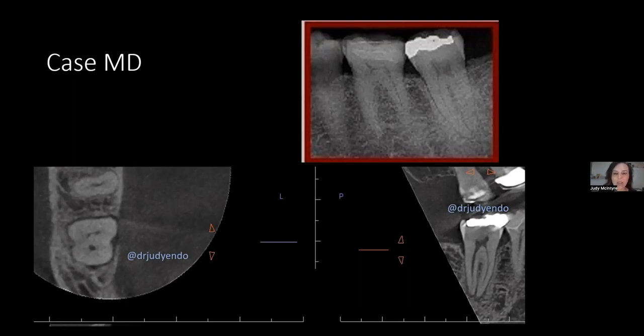are the ideal cases that I am interested in saving, okay? And these patients also really need to understand that they need full coverage restoration, either immediately or coordinated in sync with the endodontic procedure. Sometimes, if there's no endodontic symptoms, because sometimes you can just have biting pain, then I'm recommending a crown like I did with that first patient. But when there's endodontic symptoms and angular defects or cracks, clinically, radiographically, we're doing endo as well as full coverage.